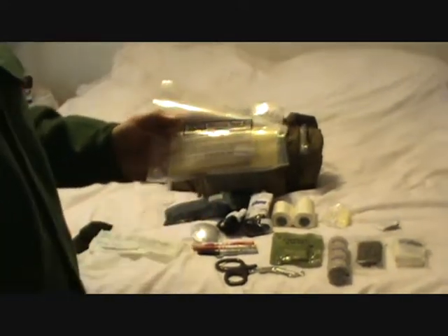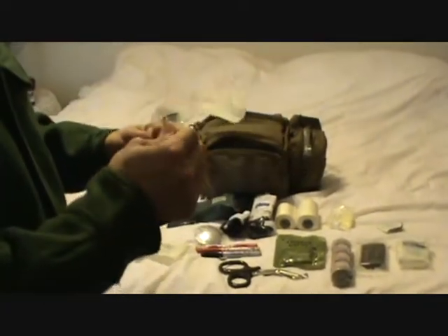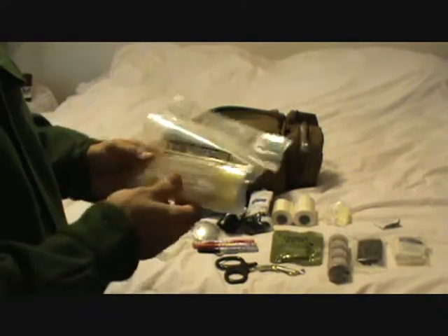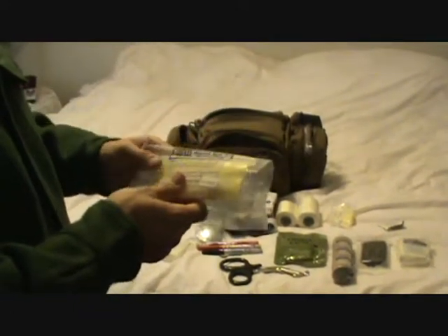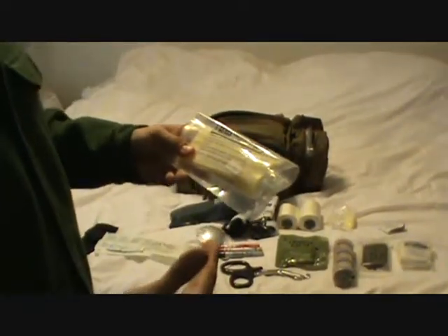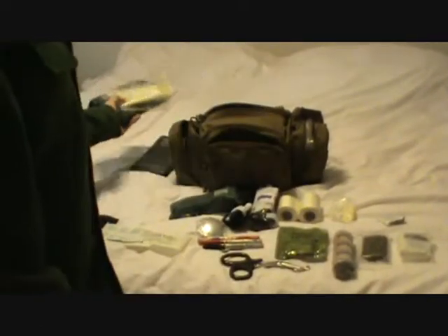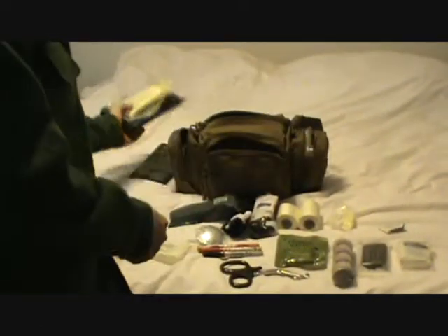With that, you would also have your wound seal kit, and I have 2 of these that I carry with me as well. These do have expiration dates on them, so you have to always check your A bag. Make sure, a lot of things expire, and when they expire, you want to go buy more stuff. You can find a lot of this stuff, like I said, on the internet, on eBay, or any first aid places will carry these. It's kind of got a tacky feel to it. You throw it over if you're over a wound or something like that. It just seals it up really well. Then you cover it with something like that. These two work together well. That's what they're used for. Like I said, I carry 2 of these and 2 of these.